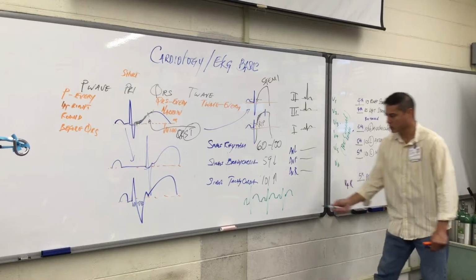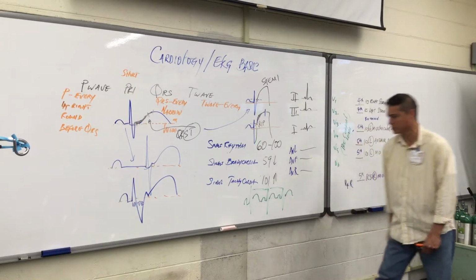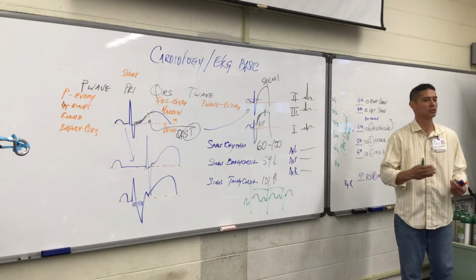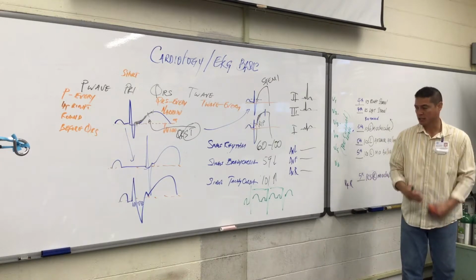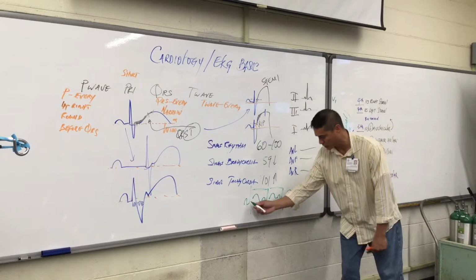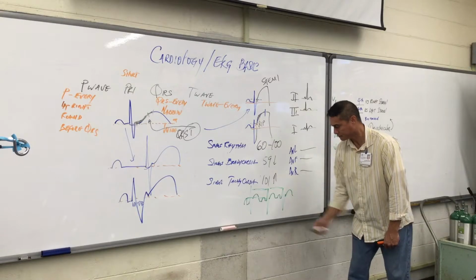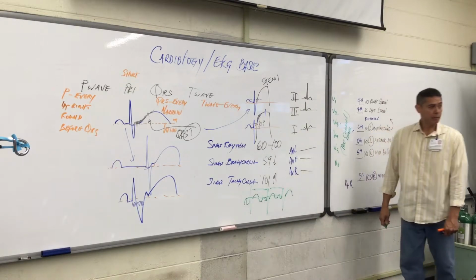What we're trying to do is make sure that from here to here, these QRSs seem to be marching up. They're as regular as possible. There's not that much deviation in the way they look and how far apart they are. In fact, we also try to measure out the P waves to see if the P waves march up.